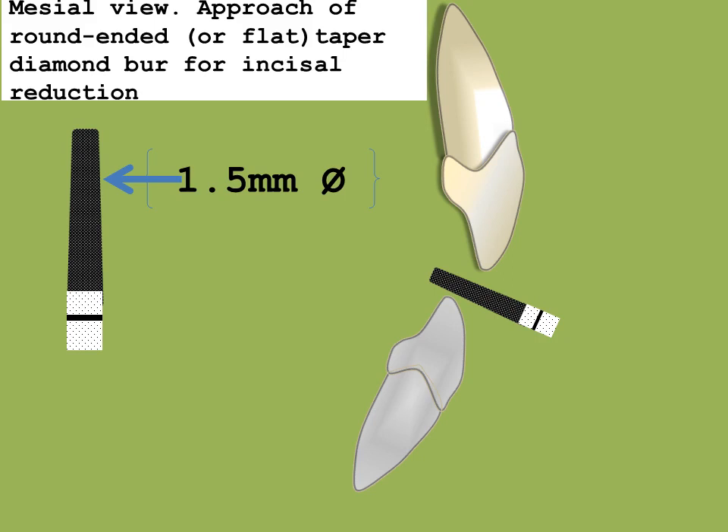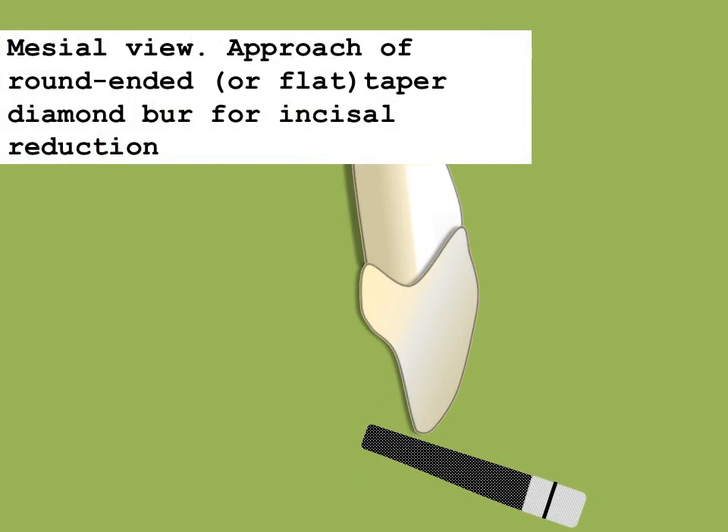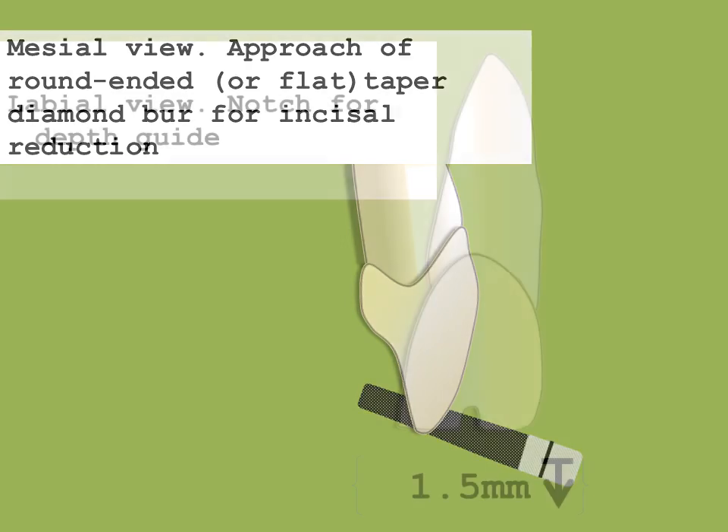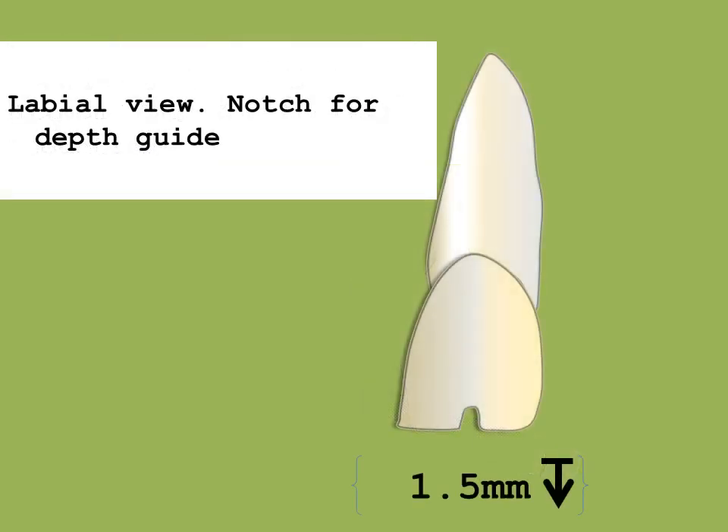And what about the orientation of the burr? The burr is oriented perpendicular to the long axis of the opposing tooth, in this case the mandibular incisor. What if the mandible is edentulous? One should not attempt this procedure unless one has fabricated a temporary mandibular prosthesis. The diamond is shown being used to produce a depth cut of approximately 1.5 mm. More than one depth cut may be used. A periodontal probe or putty reduction guide may be used to verify this.